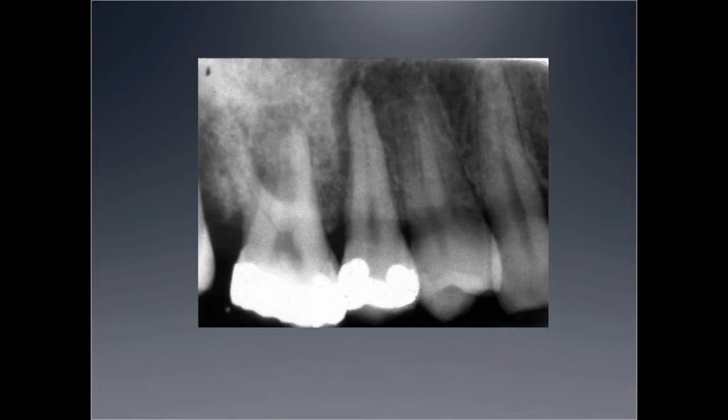Here's another case that I think makes the point of how deceptive this malignancy can be. Another periapical radiolucency in a different location, and loss of lamina dura because the tumor does invade lamina dura. Before it does that, it causes a widening of the lamina dura that's asymmetrical, and then it causes a resorption, and we have the lucency effect.